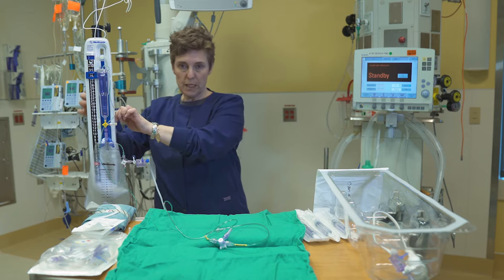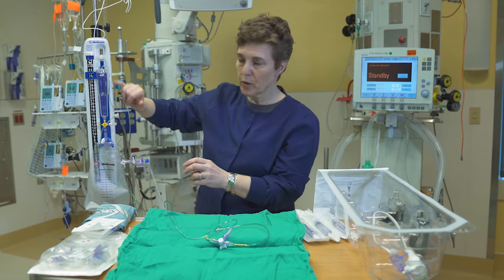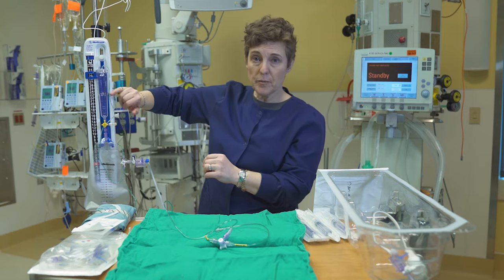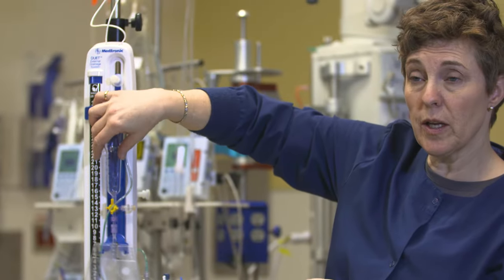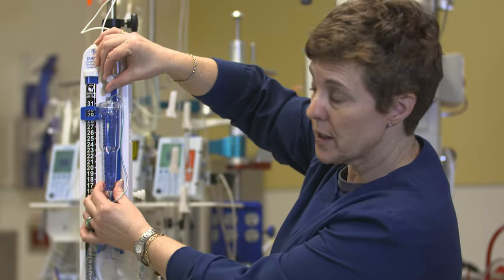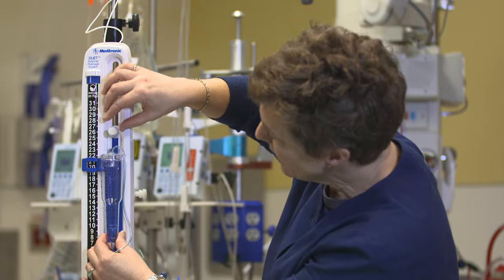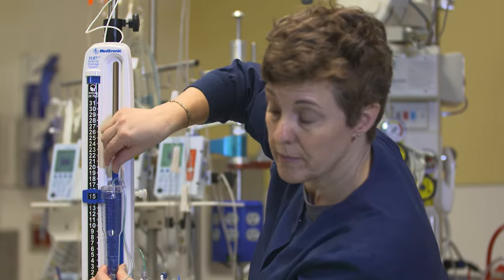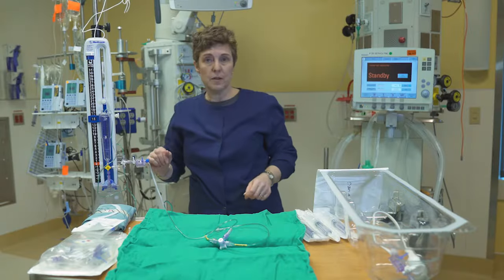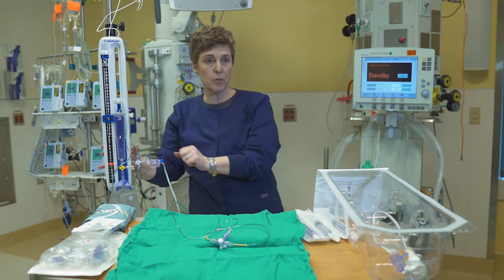We're going to level it to the patient's Foramen of Monroe and then set our level of drainage according to this piece — for right now we'll set it to 15. Then we'll level this to the patient.